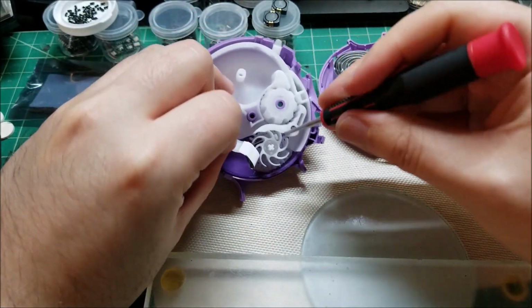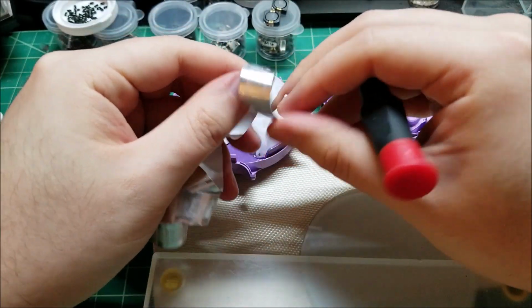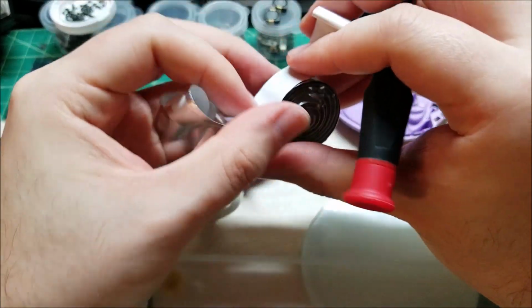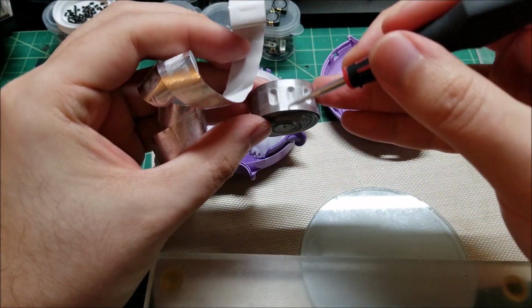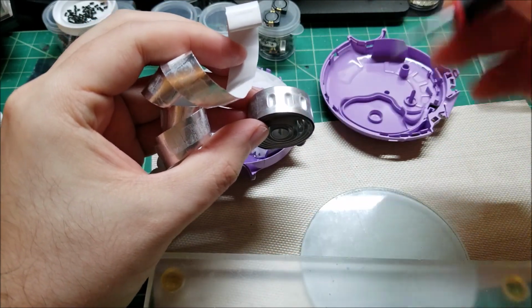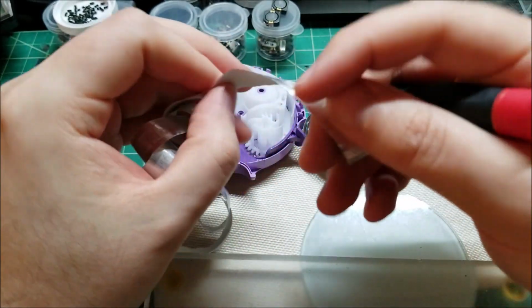There we go. And we have this kind of a peg and a cycloidal gear looking thing. And these are actually bonded together, and it basically just peels that off to expose whatever the chemical is in here. I'm guessing it's a liquid that is aerosolized so that you can breathe it in. And you can see kind of the locations where they're located.